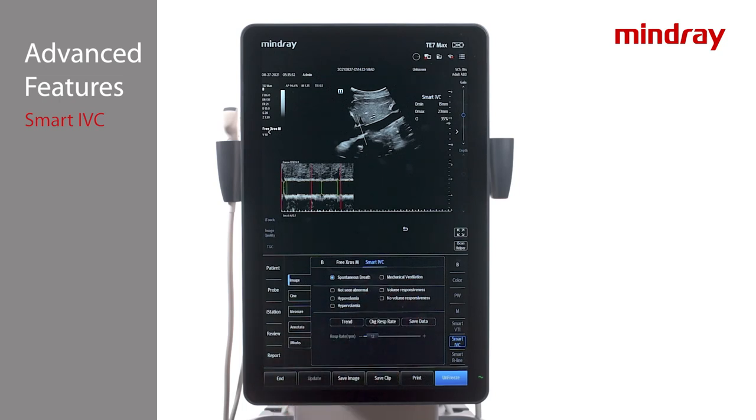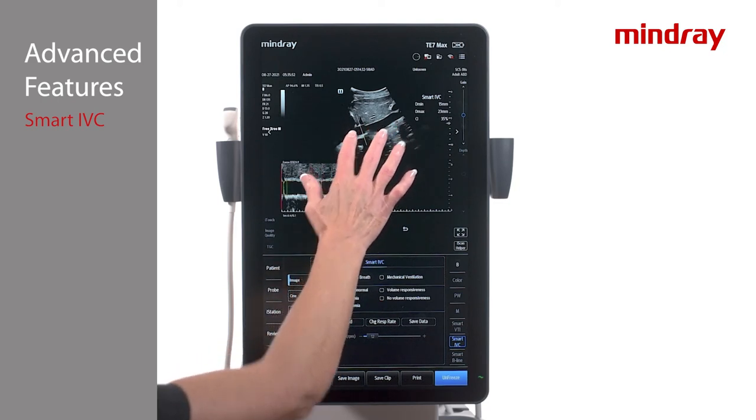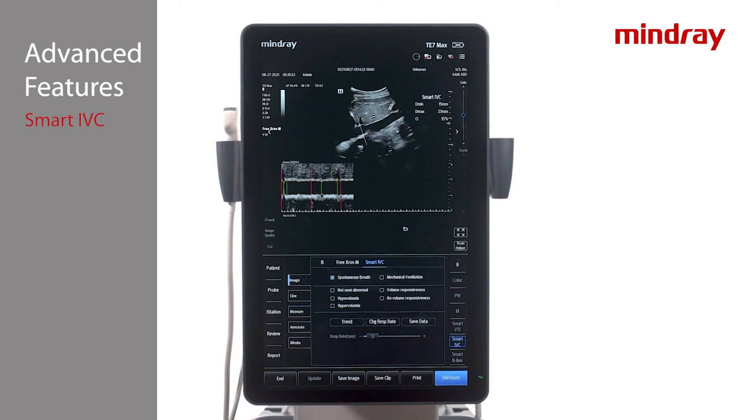If the sampling position is suboptimal, press the Edit Line tab to allow for modification of position and angle of the sampling line. To initiate a graph displaying results over time in the upper left corner of the imaging screen, press the Trend tab. Smart IVC will automatically calculate the respiratory cycle but can be edited by pressing the Change Respiratory Time tab, located to the right of the Trend tab.